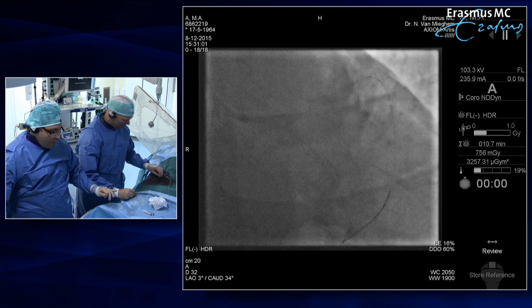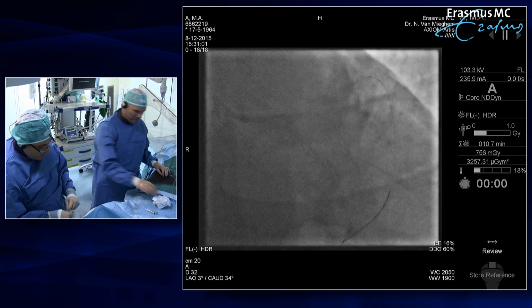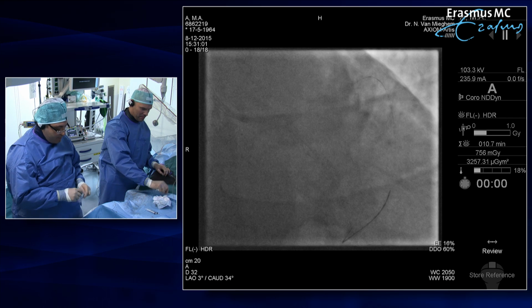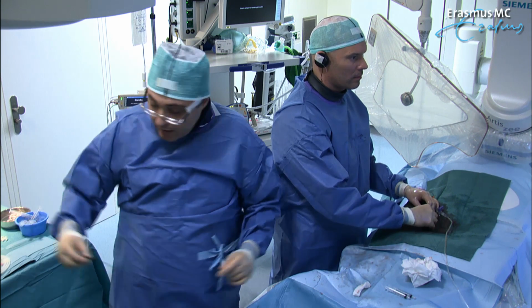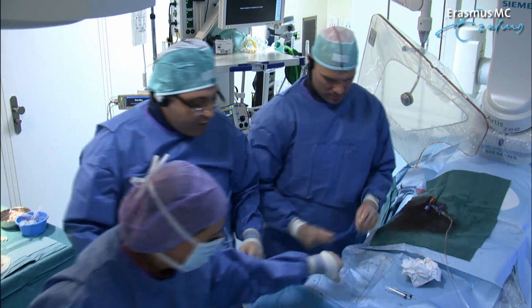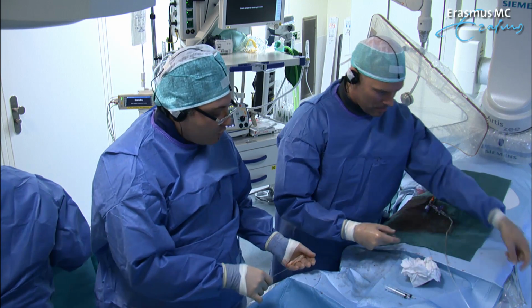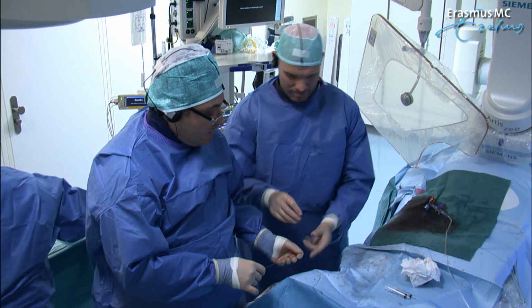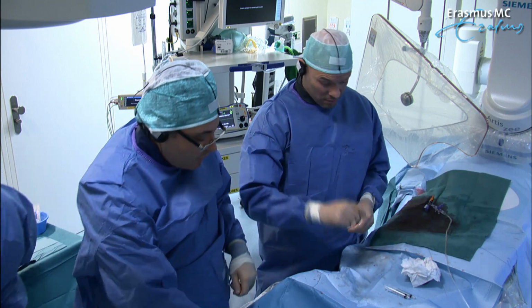So, Nicholas, I think we got a question from the audience. The question was: is it possible that the drift and the change in FFR values that we had was due to the injection of contrast and the flush of saline before our assessment?